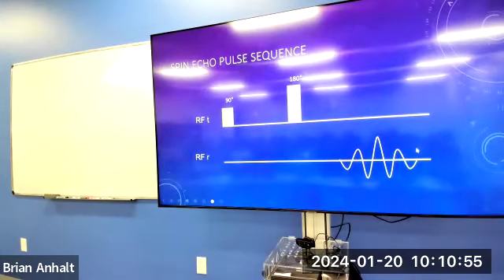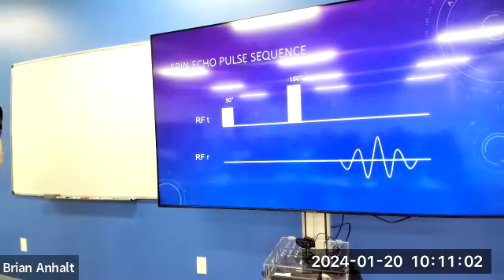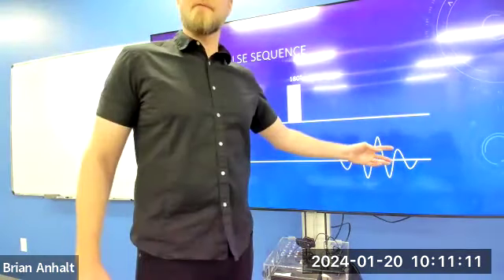Before we get into this, though, we need to understand the spin echo pulse sequence in a bit greater detail. We talked about it already, right? Remember, these echoes are things we are collecting. We have to collect several of them, right?